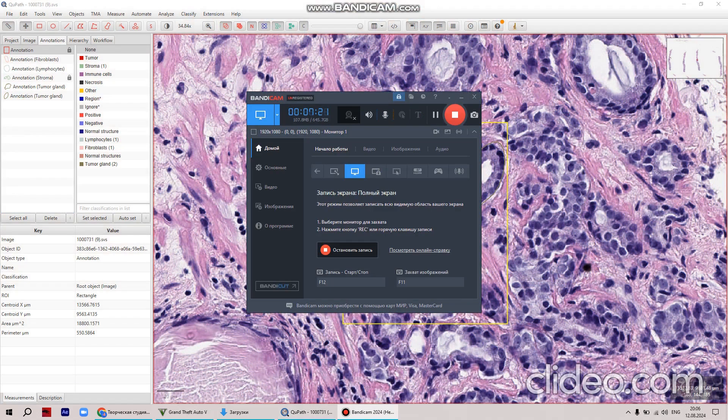For example, you can name it 'Tumor Gland.' After you complete the tumor gland annotation, you go back to the tool selection.